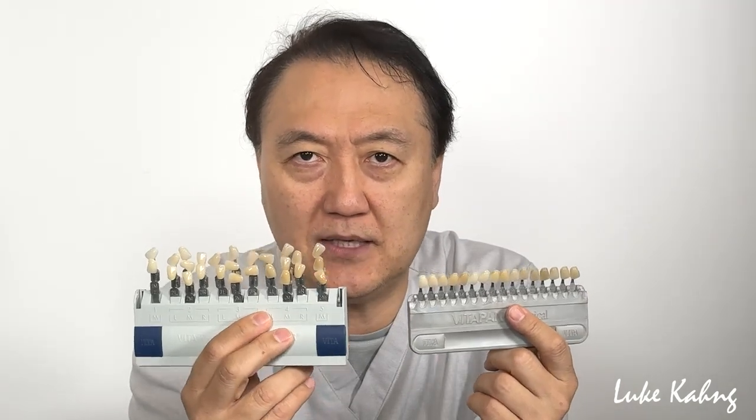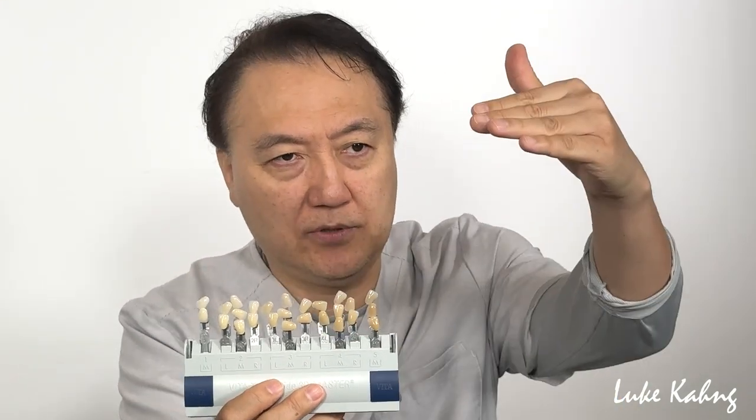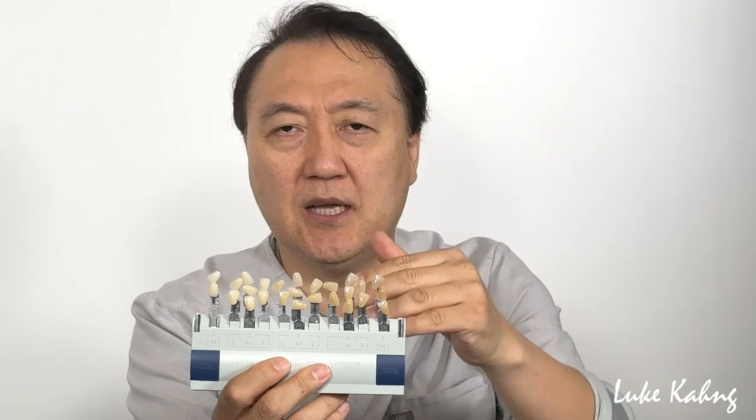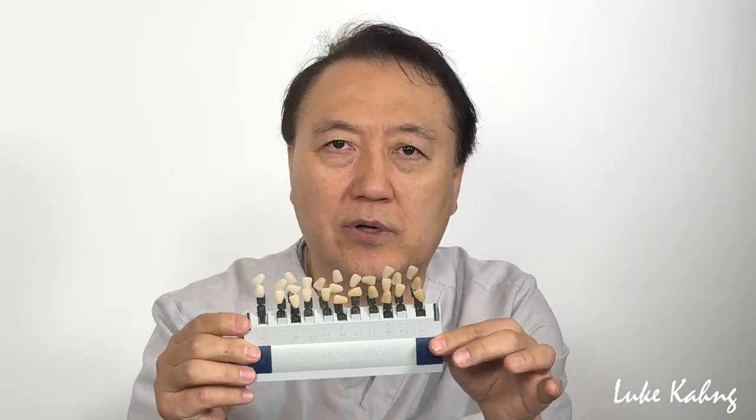So my frustration is, I'm a dental laboratory technician, I really need good tools. For example, whenever I see a patient with anterior teeth, most of them are not a match. That is very upsetting. Make sense? Without a high-end lab technician, you cannot match perfectly between natural teeth and this. But we could match with a fake restoration, because we made so many fake teeth, A1, 1M1, whatever. So that's why I fabricated this.